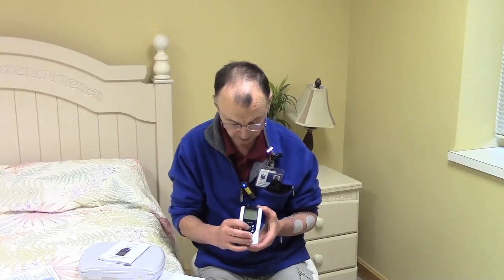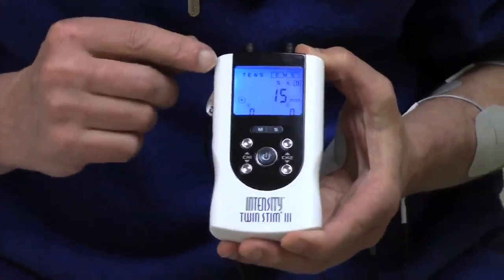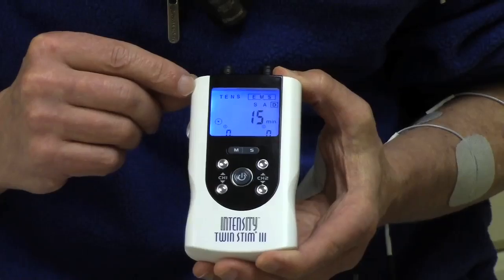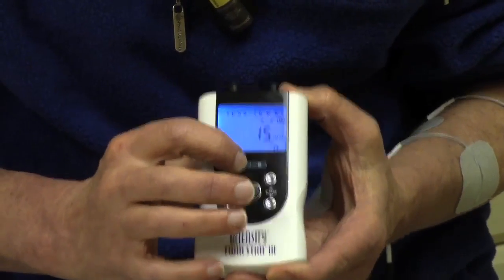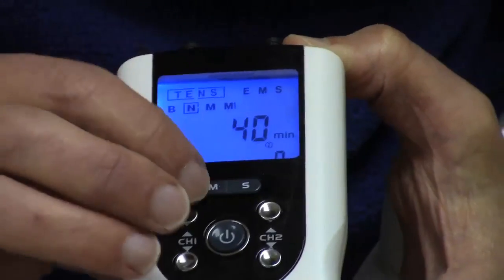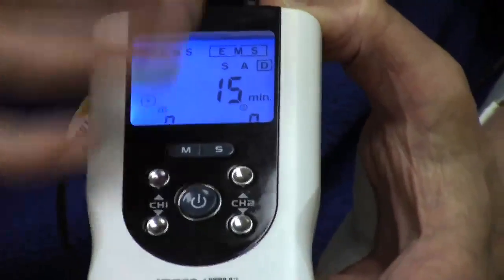To turn on the Twin Stim, you press this button. This particular device will do both TENS pain treatment and also electrical stim. If I was going to do a TENS treatment, I would press the M button and you can see it jumps over to the TENS treatment. Press M again and it jumps back over to the EMS — electrical muscular stimulation.